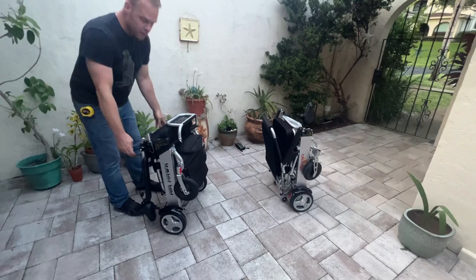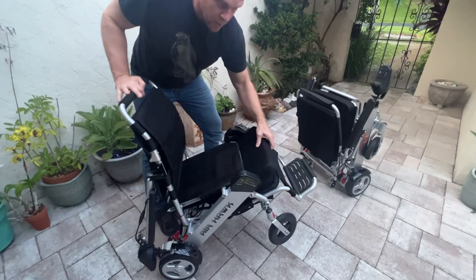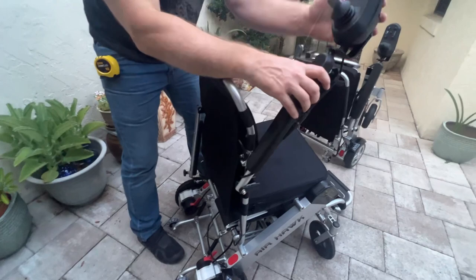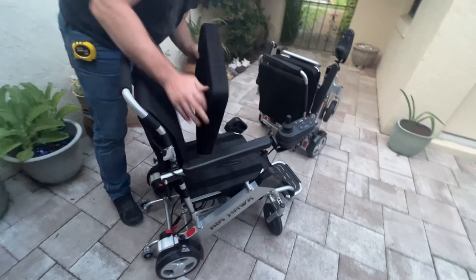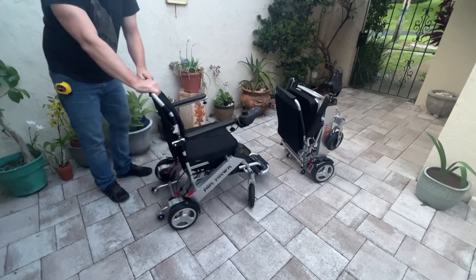Let's unfold the Air Hawk. Very simple — takes about five seconds to unfold. We connect the back part, unfold the footrest, and store the cushion underneath the chair. Sometimes the joystick turns on while I unfold it, so I'll turn it off. There is a wire in the back of the chair that I pull to lock it into place. I'll go ahead and put the cushion on the Air Hawk, fold the other arm over, and the Air Hawk is ready to go.